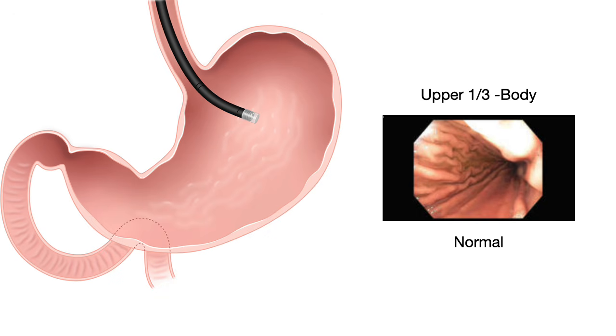The purpose is, this is where all the secretions pool, the gastric acid, or any residue that pools down here.